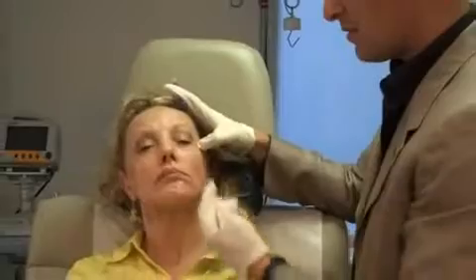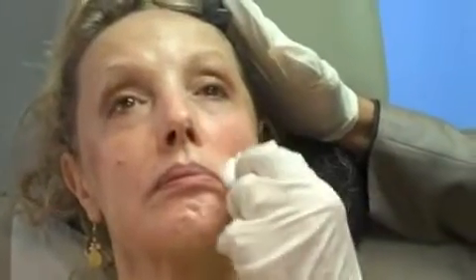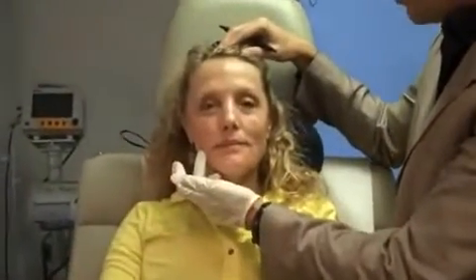Let's get a little fade back view so we can look at the two sides right now. Okay, she really has very little trauma, very little bruising or swelling. Actually, it's going to look a lot better in a few days, but you can see what we've done already. Now she has the normal contour of her face and a straightened out jawline. So let's take her and give her a little break before the other side. Okay, so we're done. I finished the other side.